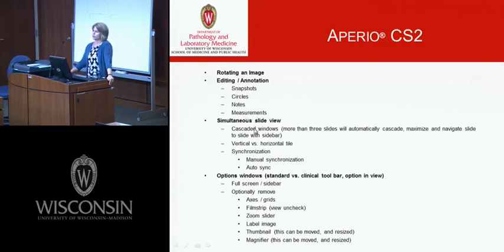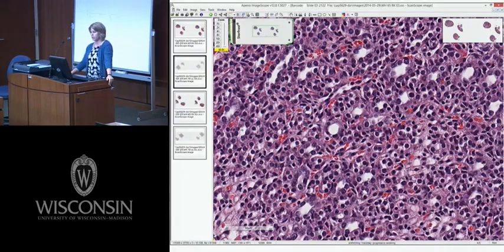It will allow you to open numerous windows. It will allow you to synchronize multiple slides together. And this is a very nice imaging, just a visual imaging tool. And so here we have a screenshot of what typically can be seen with the Aperio slide scanner.